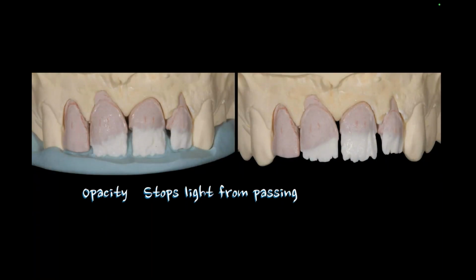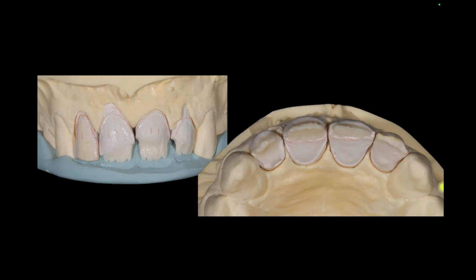I may have to add in a fluorescent stain sometimes, but I have to do something to bridge that gap between where there is air, where there is nothing, and where there is tooth structure. And to do that, it becomes your knowledge of the materials that you're using and how to create the opacity that you really need.